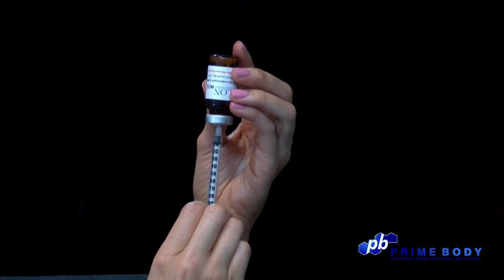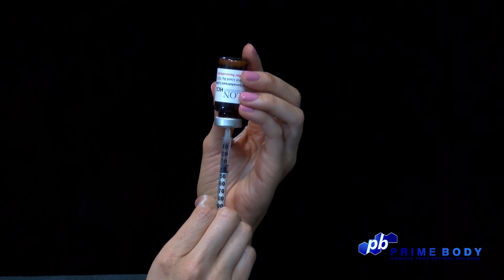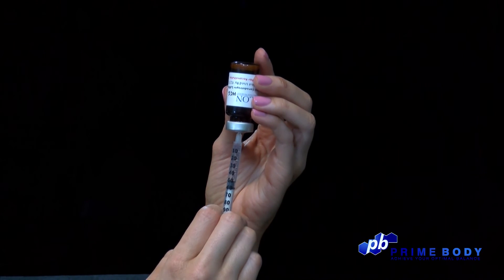Turn the vial upside down and withdraw the prescribed amount of HCG, which is 0.5 milliliters in this case, using the top of the plunger as your guide.